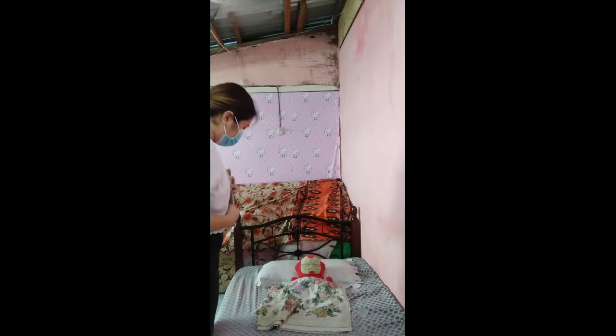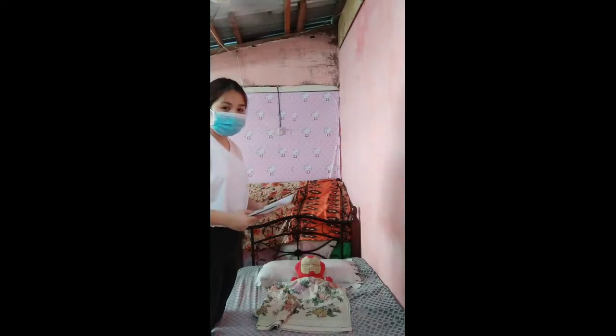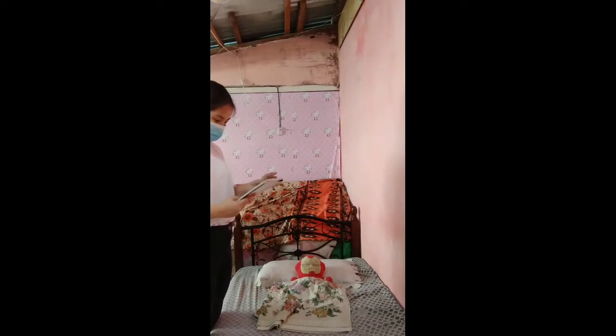I'm from BSN 2A7 and I'm here to perform the female catheterization. So, let's do it. Hi, ma'am. I am Margaret Sumukad. I am your nurse for today, so I am here to perform catheterization for you. So, the first one is we need to check the doctor's order. So, the doctor's order. Okay, perfect.